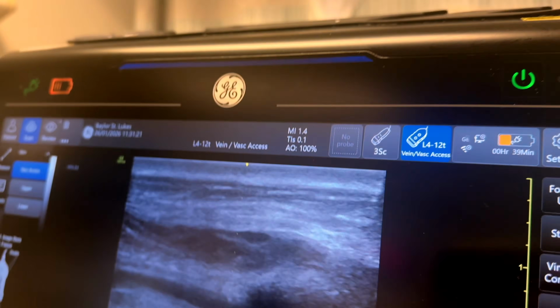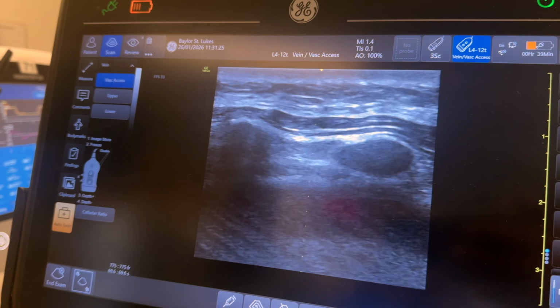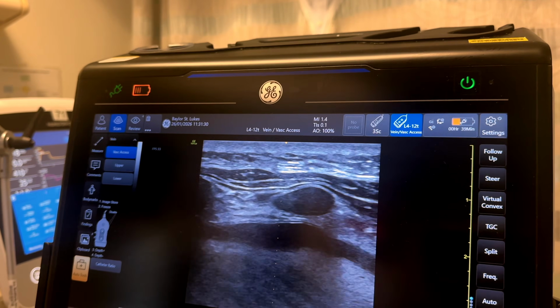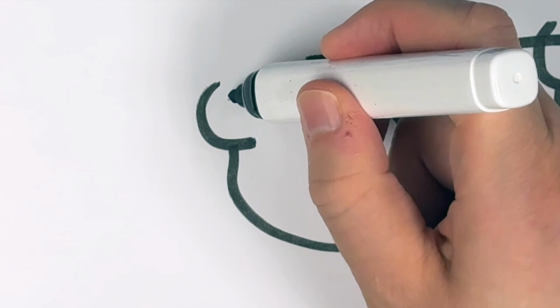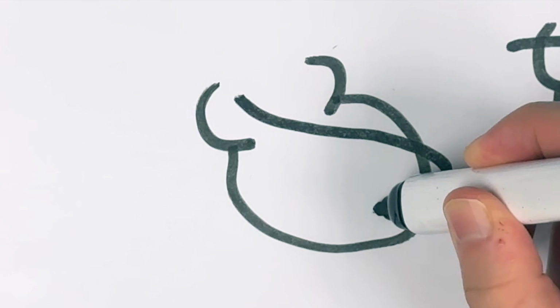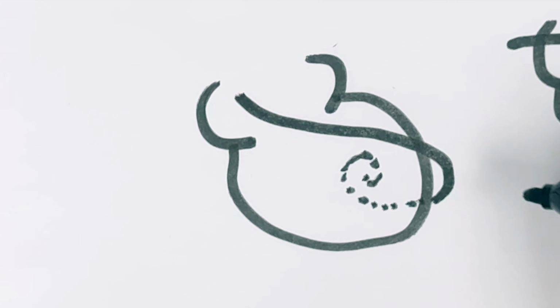That's where you'll always find fluid, and the added advantage is that if you do access that space from this angle, the catheter will always wrap around the heart. Because you're inserting from medial to lateral, the wire will go medial to lateral, and when you place your drain, it'll actually wrap around all the way across posteriorly, and you'll find that you have maximal efficient drainage.